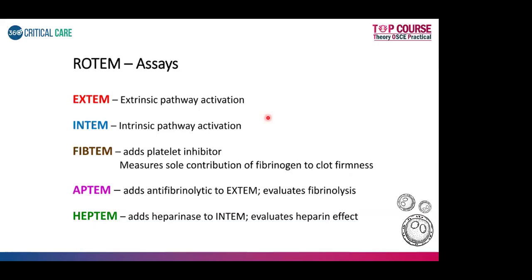After that, to see heparin's functionality, whether it is reversed, what will you do? HEPTEM, correct? So first do an INTEM. Then if you add heparinase to the INTEM and it gets normalized, that is your HEPTEM. So that will help you understand the effect of heparin. For every other thing, be it FIBTEM or APTEM, you have to first see the EXTEM and then see whether FIBTEM is the issue or APTEM is the issue.